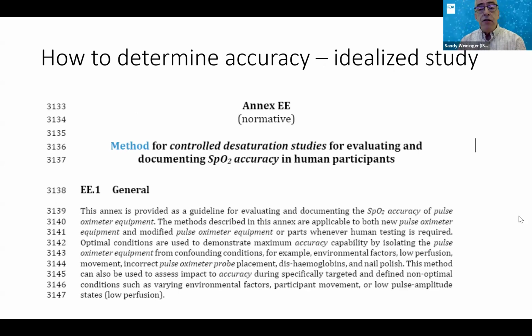Remember, the traditional standard looks at the products on the market and says, how can we make these things comparable? What test methods do we have to put in place? What acceptance criteria have to be there so that from a US perspective, we can evaluate substantial equivalence. The rest of the world doesn't use the concept of substantial equivalence. They have objective assessment criteria. And in some cases, we can establish those acceptance criteria. In other cases, we don't have the science yet in place. Next slide, please.